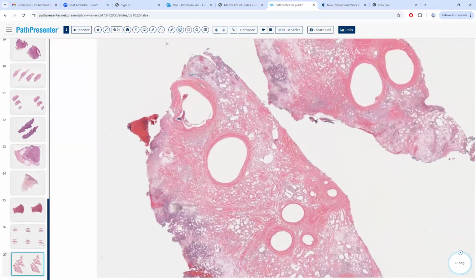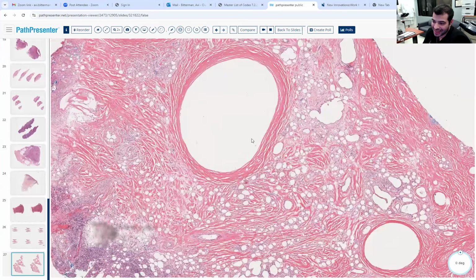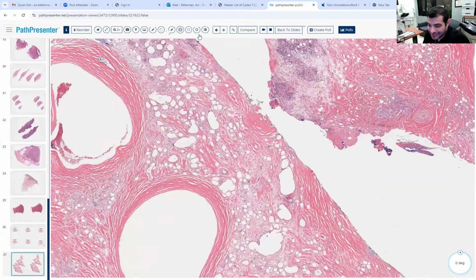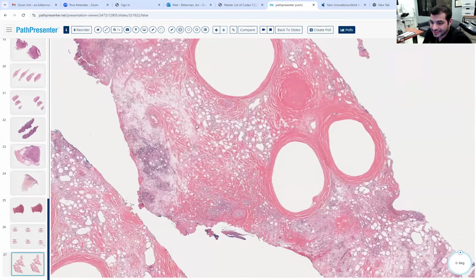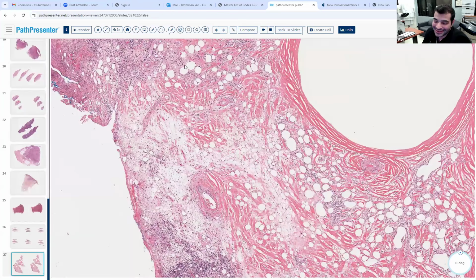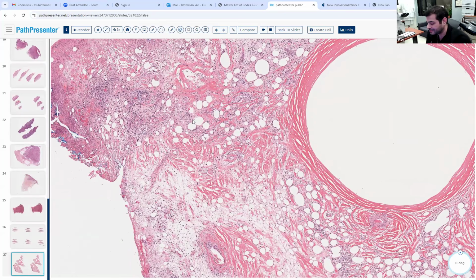Do they need to have these huge holes or not necessarily? No, if you got a biopsy with a section of this, would you even see the giant ones? So what do we call it? You already said it's silicone. Silicone granuloma. Well, there's a name for it, but I don't actually know.